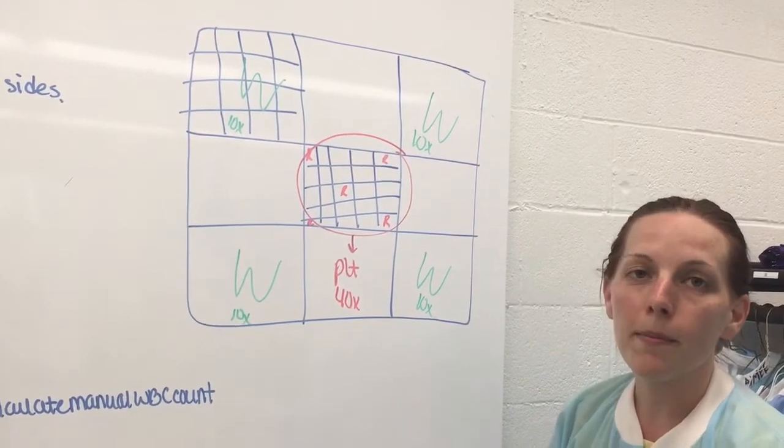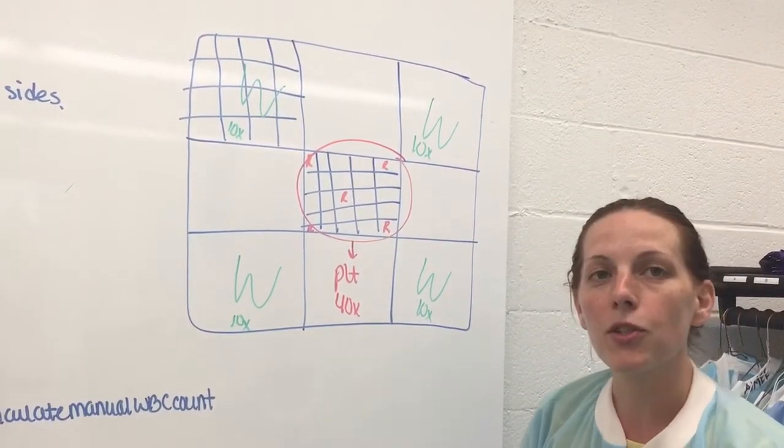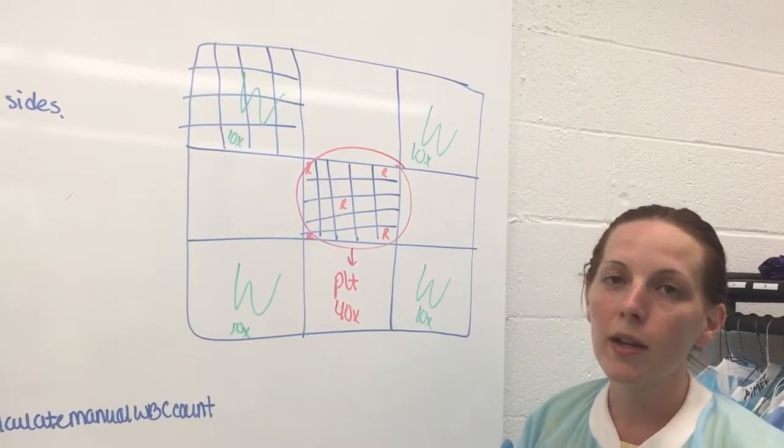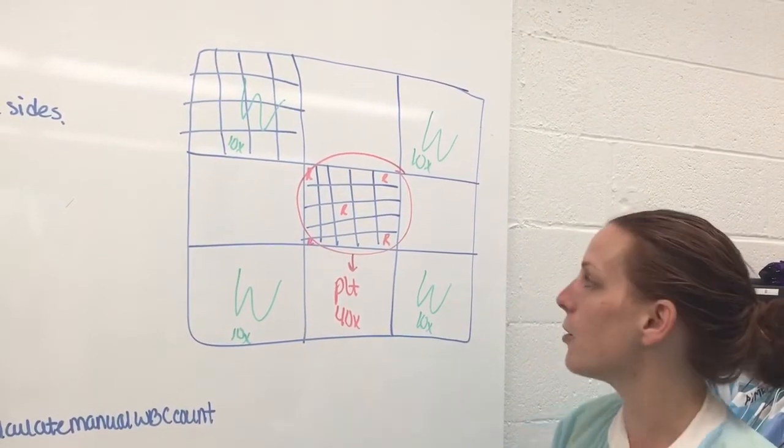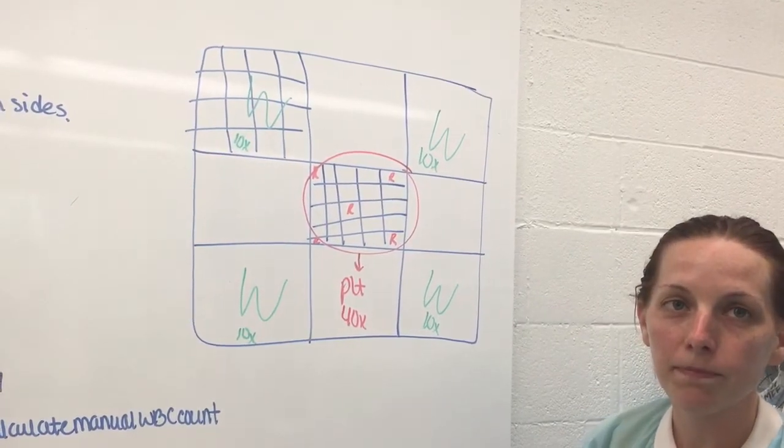We'll go over some hemocytometer worksheets as well. I'll give you some things that you can practice with them so that you can figure out how the area that you count changes based on what kind of squares you're using in your calculation.